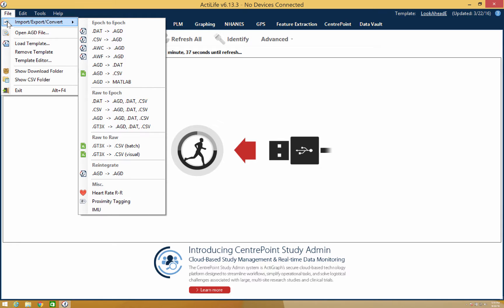You'll also be able to reintegrate your .agd files and export your additional files such as heart rate and proximity tagging.